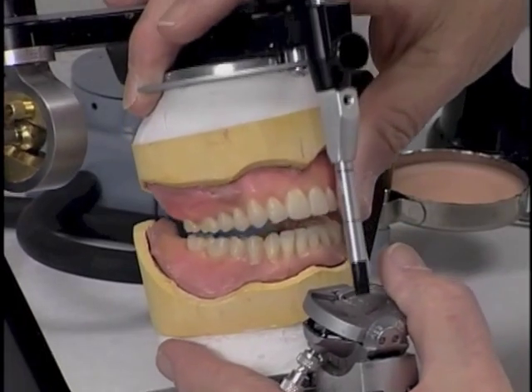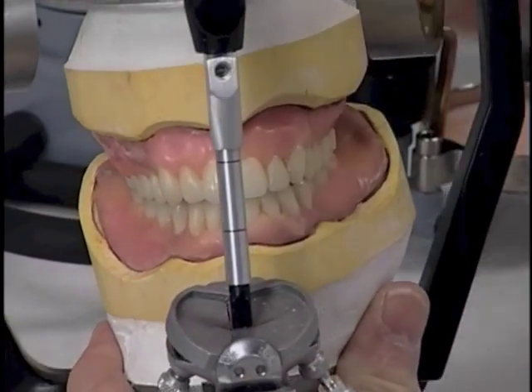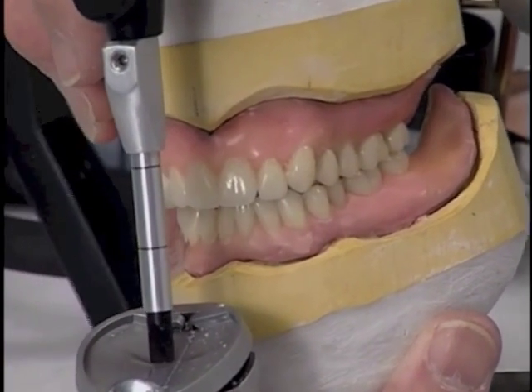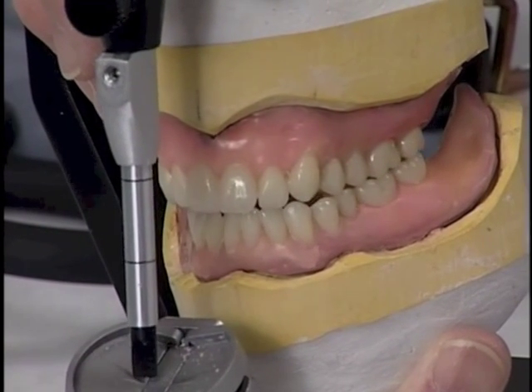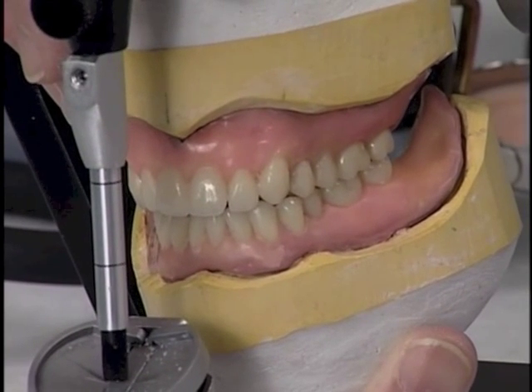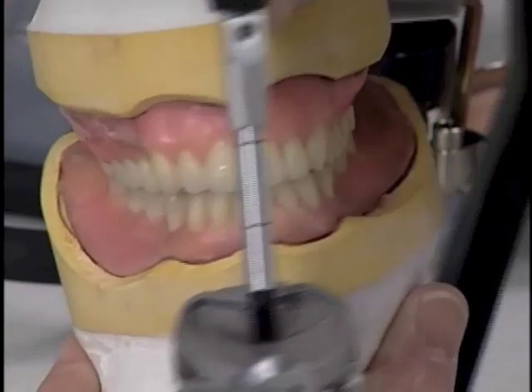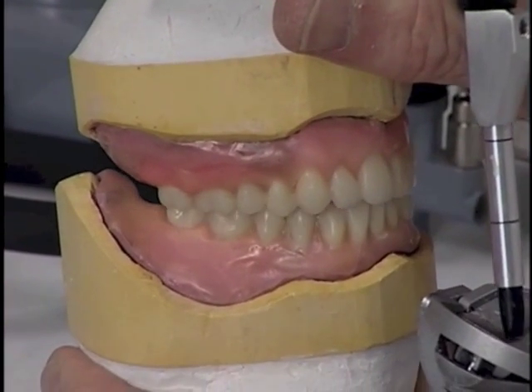When we close the articulator with a good cross-arch balanced occlusion, we should see that when we go into working relationship, the contact of the cusp slopes of the maxillary teeth contact the cusp slopes of the mandibular teeth. And we come around to the opposing side, the patient's right side, and we have the same thing.